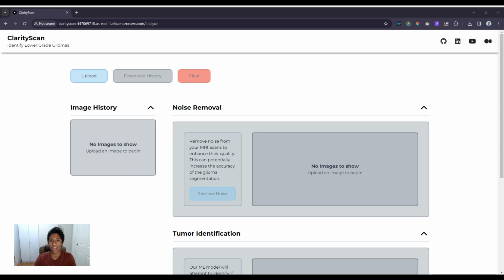I hope you enjoyed the demo. I certainly enjoyed this whole process of building this application. I learned so many cool things along the way, and we'll dive more into those in the technical video. But yeah, this project has been amazing. I've been working on it for about the past month, and I'm really pleased about how it turned out.